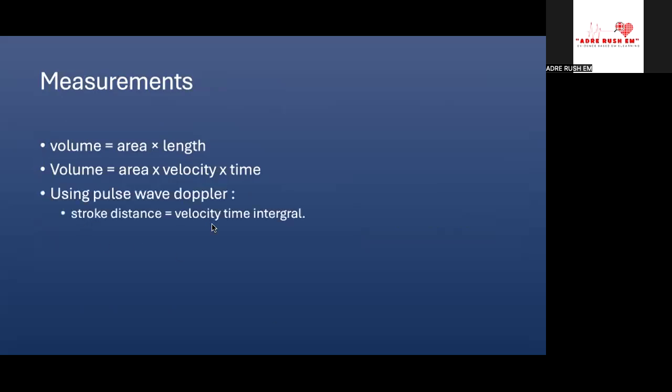Using a pulse wave Doppler, speed into time is your distance, right? So velocity into time. Using your pulse wave Doppler, stroke distance is nothing but your velocity time integral.